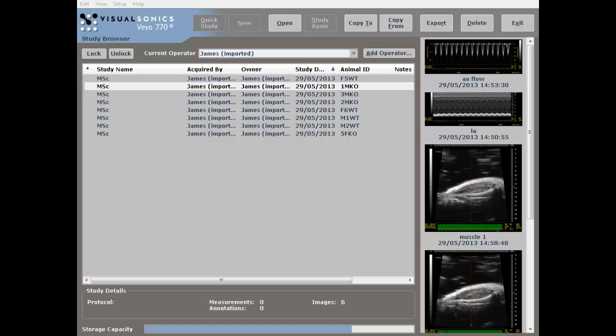abnormalities, you've got to be very careful about using this one-dimensional analysis, because you may be missing some very important physiology, which those of you who understand cardiac physiology will realize the importance of when you see the data analysis that we're using. But if you're just comparing normal mice, this is quite a quick way of getting some data to be able to look and see how these mice compare, certainly in terms of average wall thicknesses, lumen sizes, and function.